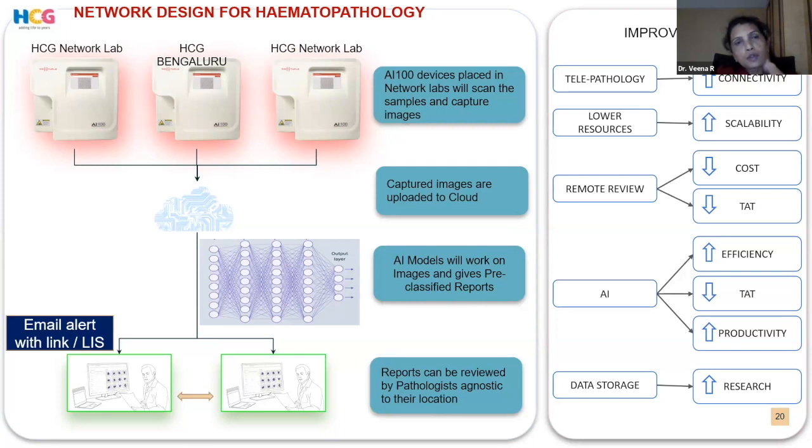So they also have a look at the images, and we have designed it in such a way that there is an email alert that goes to the pathologist that this particular case is ready for viewing. So they usually see that and then they report.